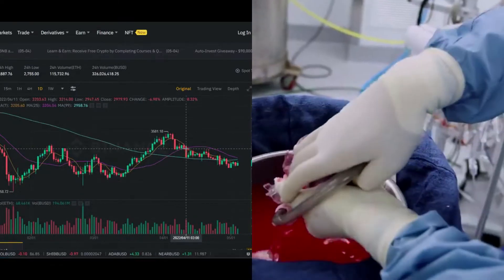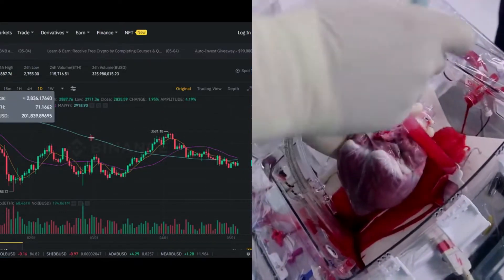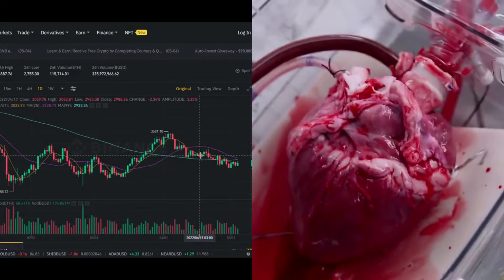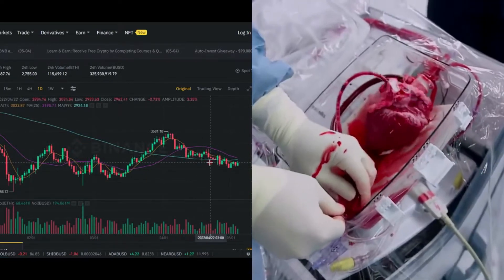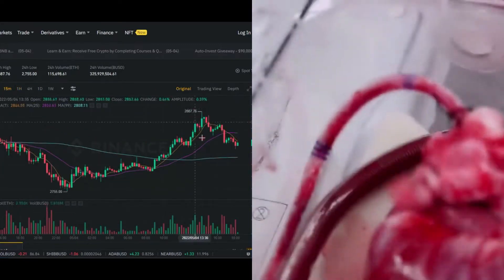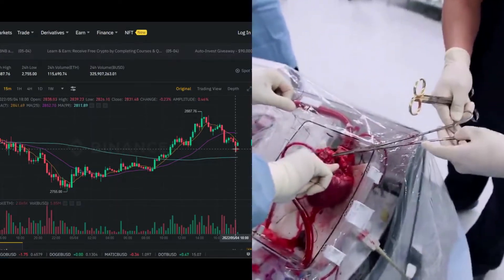Once removed from the donor's body, the heart is quickly connected to the device through the aorta. It continues to receive warm blood as well as a proprietary formula of nutrients. TransMedics showed how the device allows clinicians to monitor the heart's rhythm.